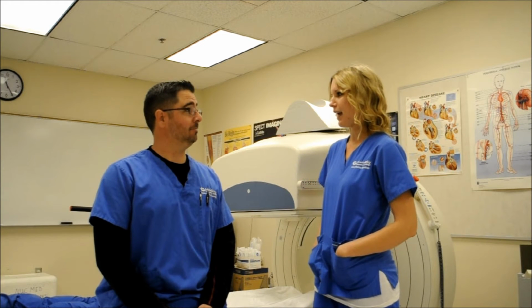Different infections, rule out osteomyelitis versus cellulitis. It's great for patients who have a prosthetic that's loosening, might be painful, and for diabetic ulcers. So in this case, Rusty has a loosening prosthetic in his knee.